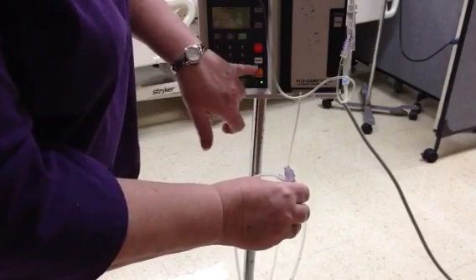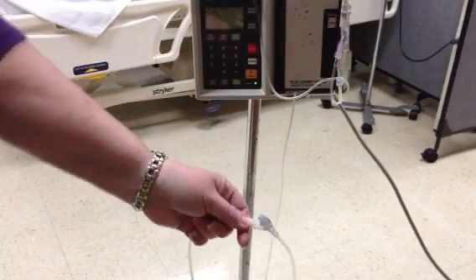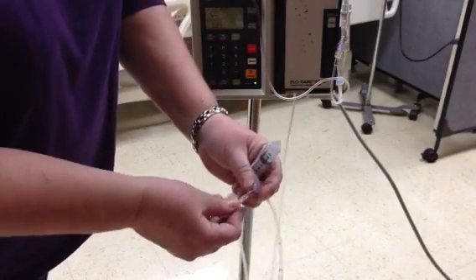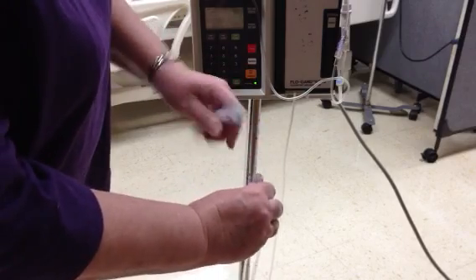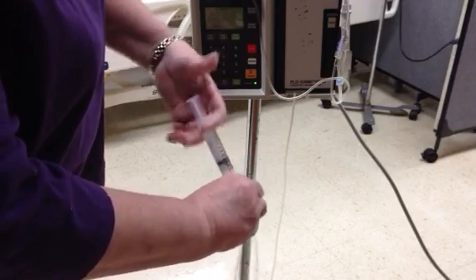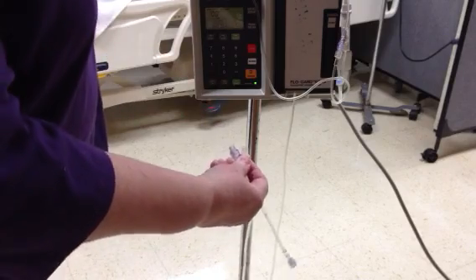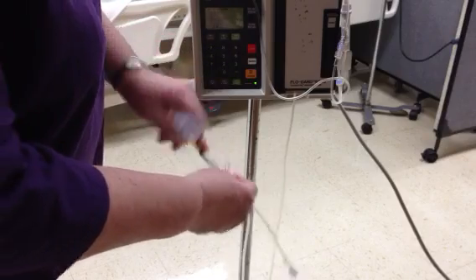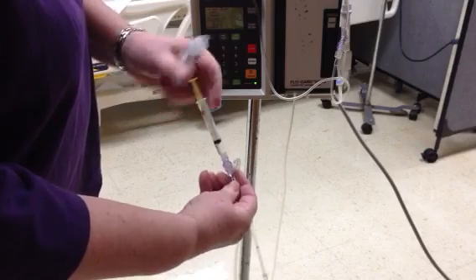So I'm going to turn my pump off. I am going to pinch off above the line, cleanse my port, flush with saline. I'm going to push in 3 milliliters of saline at a normal slow rate. Then I'm going to come and I'm going to push one line every however many seconds it's supposed to be pushed.